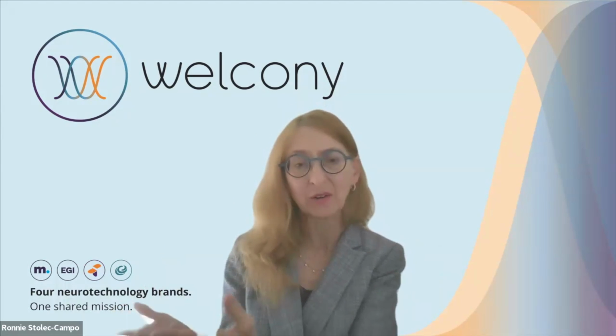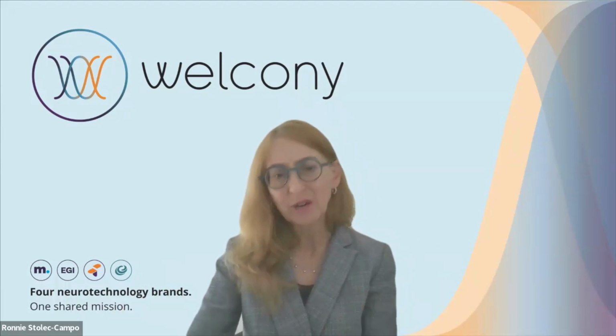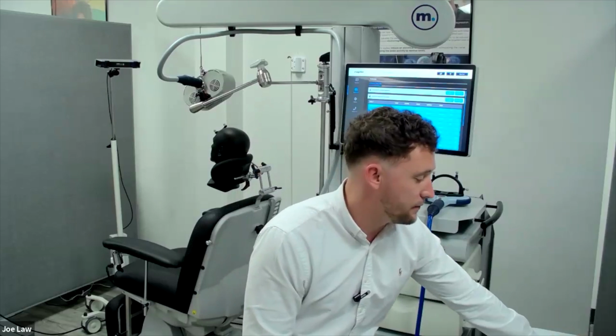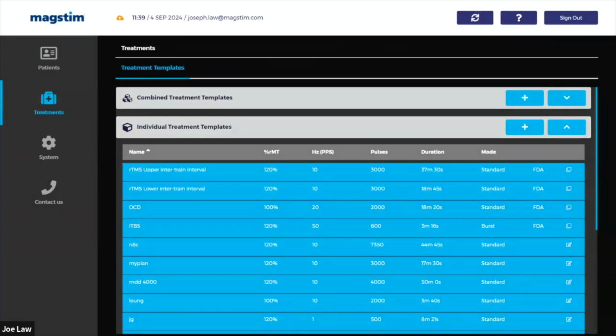Joe, if I'm a researcher and I'm doing a clinical trial and I think I have a better accelerated protocol that I want to test in this clinical trial, can I put that accelerated protocol in as an individual? Great question. So yeah, the same again, you've got the option. You can either go ahead and click the plus to just add a modified or adjusted version if you want to save both.